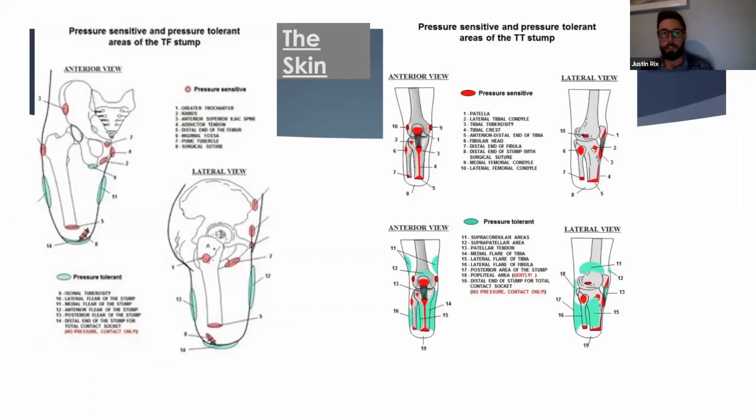These images indicate where pressure tolerant and sensitive areas are, where the green is tolerant and the red is sensitive. So for us, care should be taken not to place suture lines over bony prominence or subcutaneous bone. The more skin surface available for contact with the prosthetic socket, the less pressure will be applied to each unit area of skin.